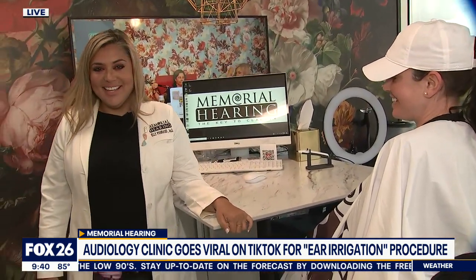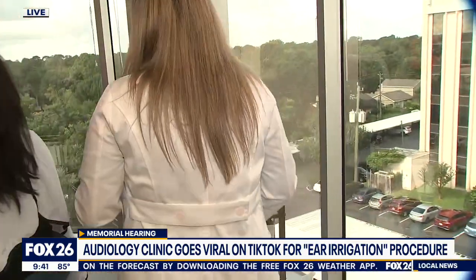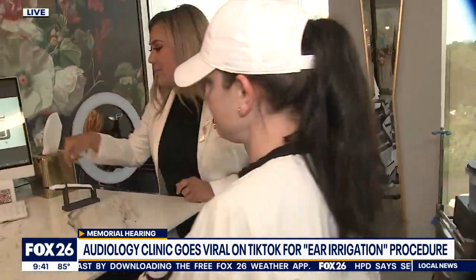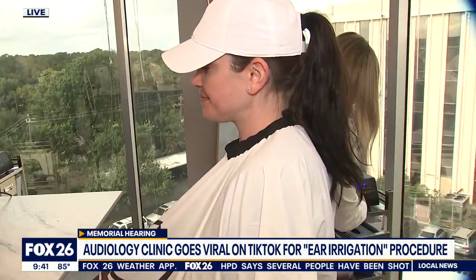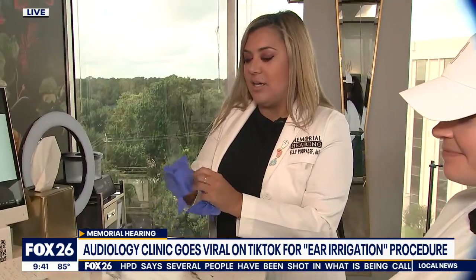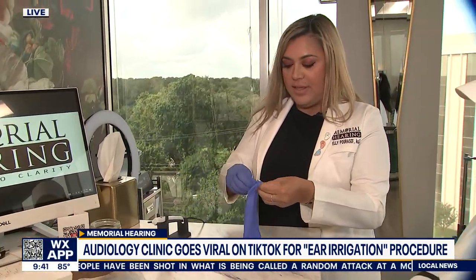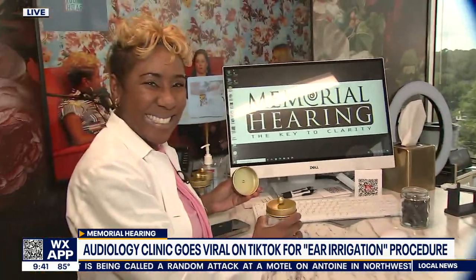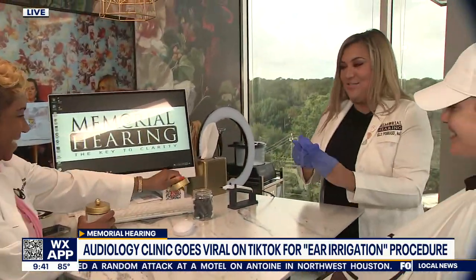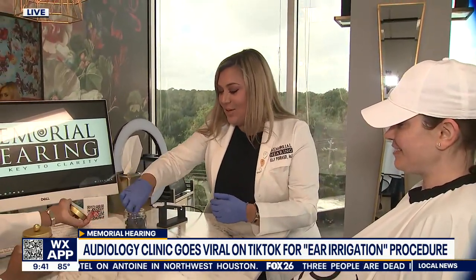So basically the first thing we do is look at the ears. And then the next thing we normally do is make sure there's not a perforation or hole in the eardrum, because if there is, water could be a problem. This is Dr. Wiggins — she's another doctor here and my assistant for today. So we look in the ears.